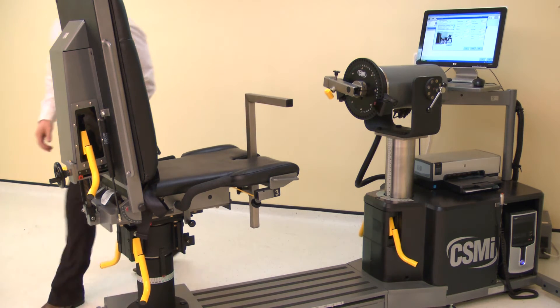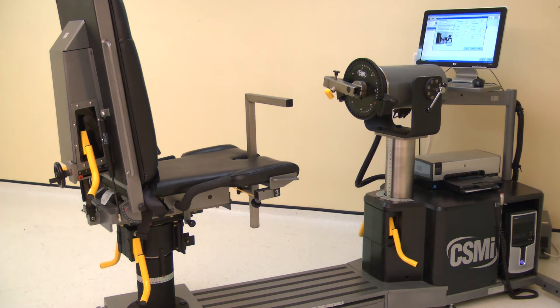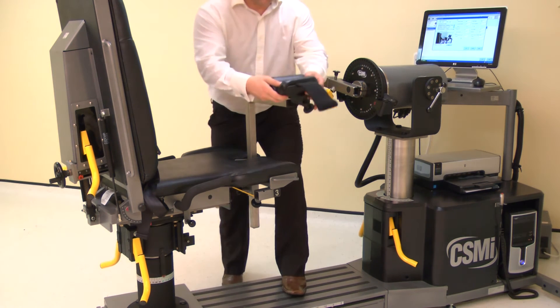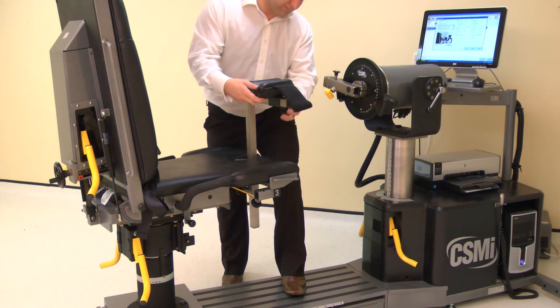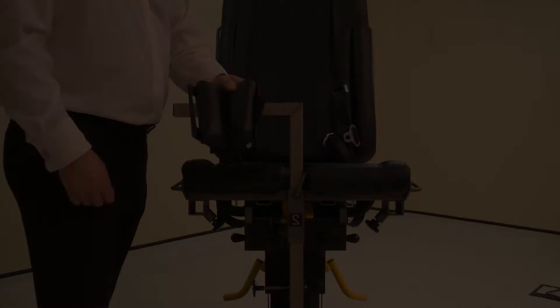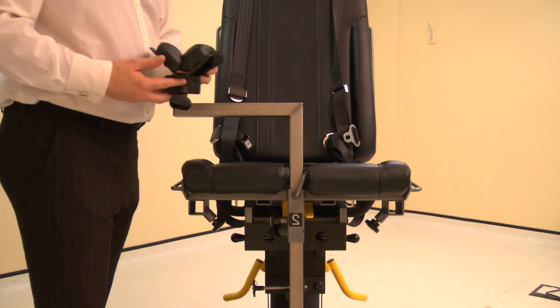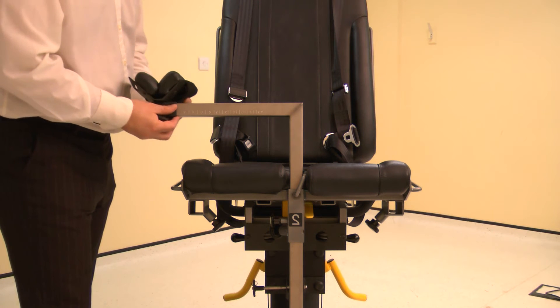Top tip: leave the stabilizer high enough to slide the leg underneath. Attach the forearm stabilizer V-pad to the stabilizer tube. Ensure the wide part of the pad is towards the chair, then slide onto the stabilizer tube. Secure with a screw.